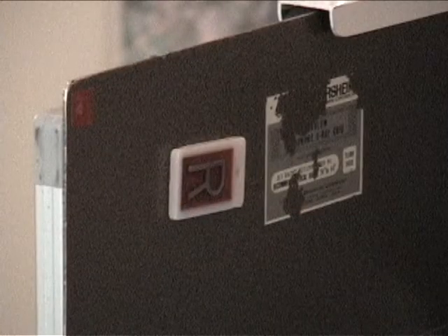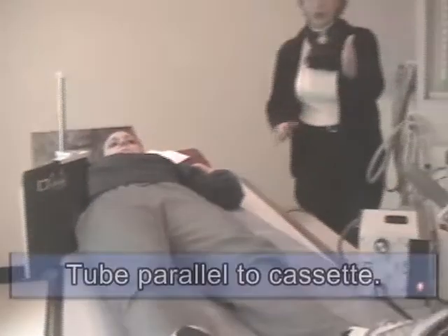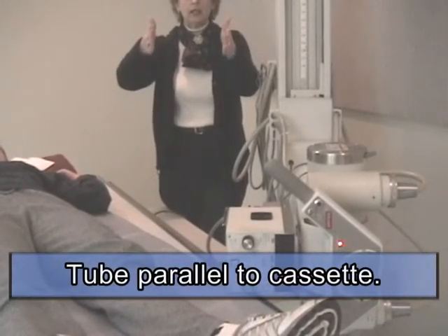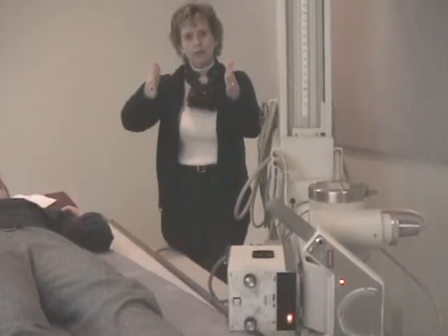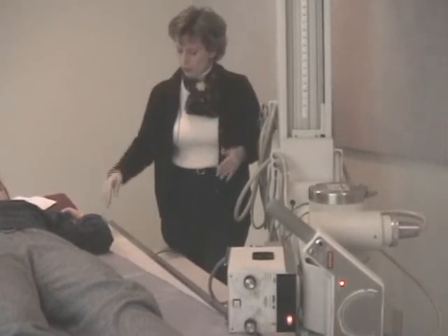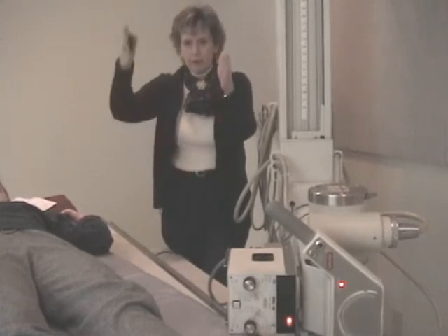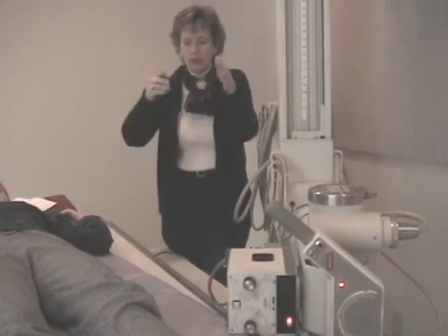Okay, now we're going to focus on the tube for a minute. For the tube setup, I want the tube parallel to the cassette. Beginning students, that might be a difficult thing to perceptualize, so here's a trick that you can use. Again, tube and film in a parallel relationship.